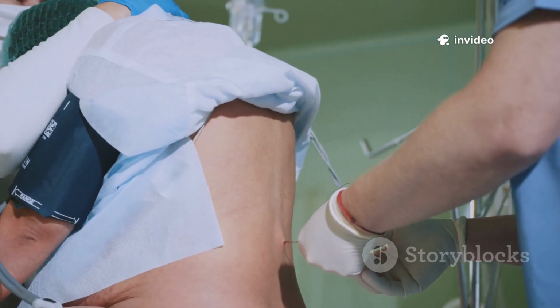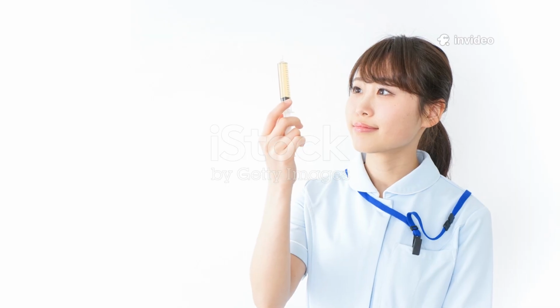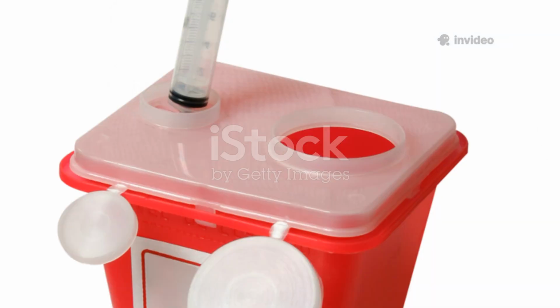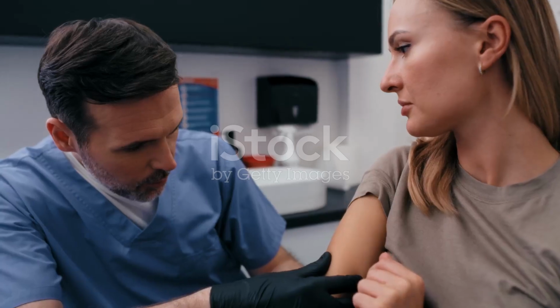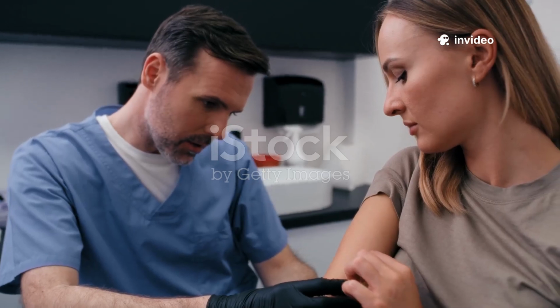Withdraw the needle gently. Apply gentle pressure with cotton. Do not massage the site if contraindicated. Dispose sharps safely. Possible complications include pain, infection, nerve injury, and tissue damage.